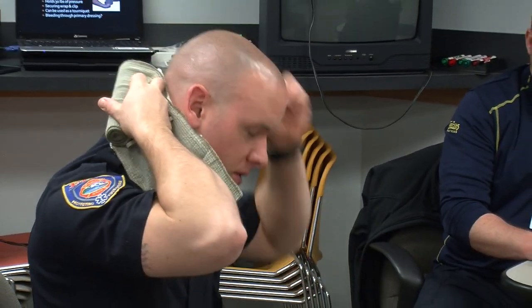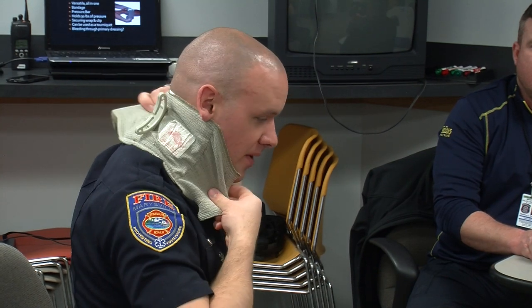If I've got a neck wound, as long as it's not directly in the front, I put this on the neck wound, put it here, and then wrap underneath the opposite arm. To do it to myself is not going to work. But wrap it underneath that opposite arm so I'm not blocking off their airway or anything, and then same thing, through the pressure bar and back the other way, I can put pressure on a neck wound relatively easy. Because otherwise, you're going to have to sit there and manually hold it the entire time.